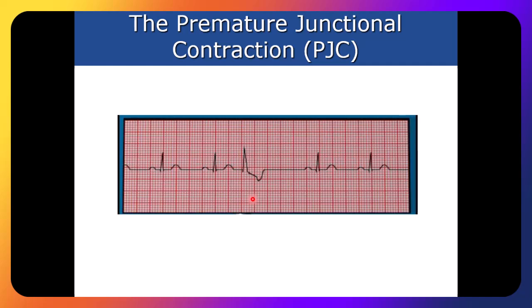So we've got an inverted T wave down there. Okay, so that'd be one thing. What else? Good faith. What else? Don't go dead on me now, guys. You got some extra points on this test.